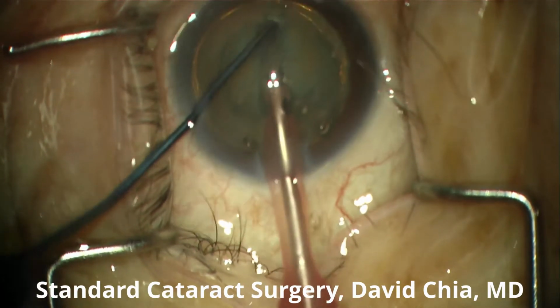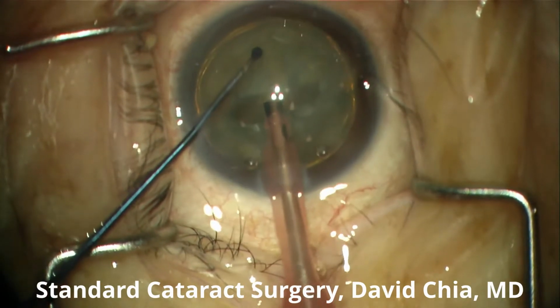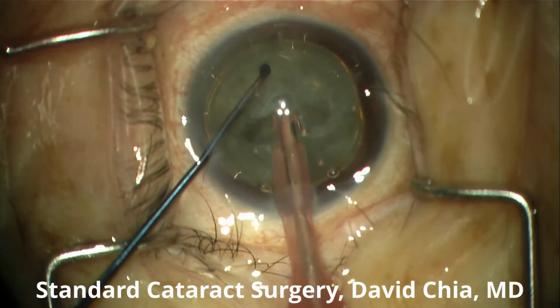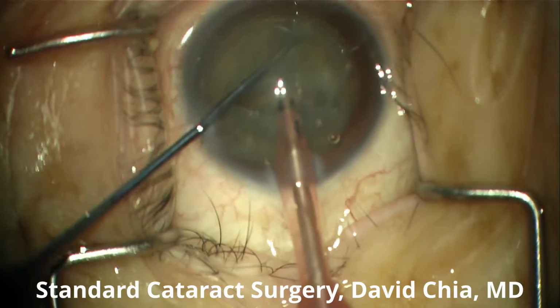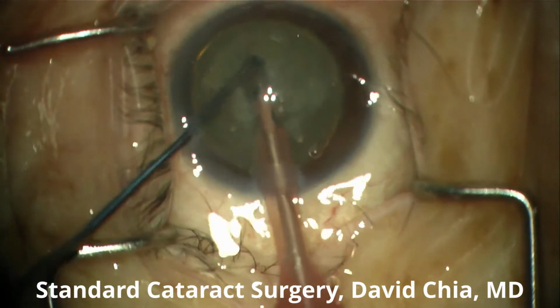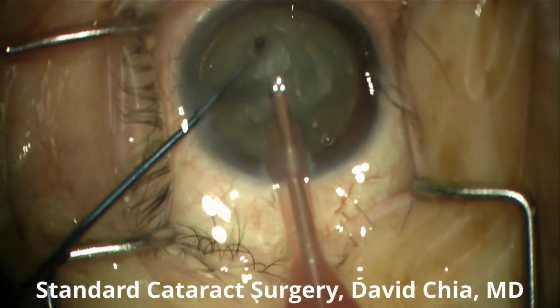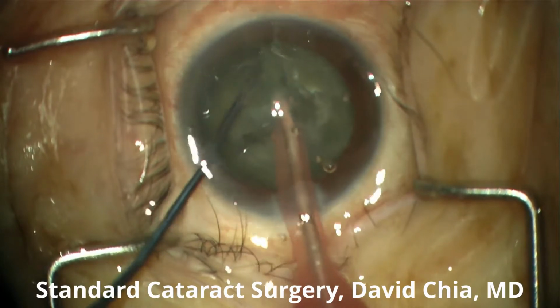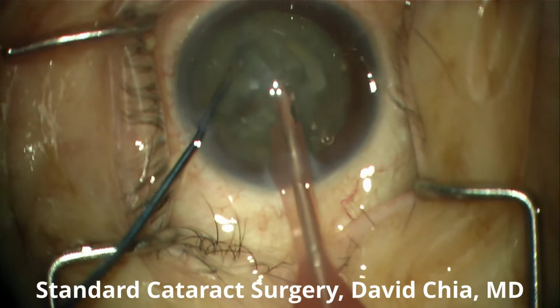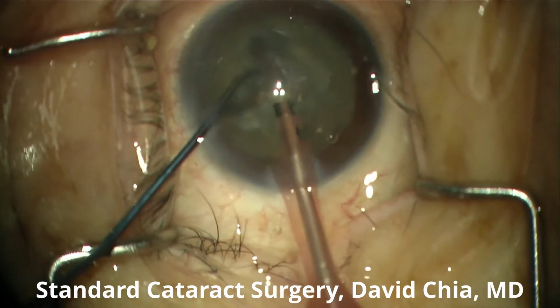It appears that this is freeing fairly well, and so we're going to be using the stop and chop maneuver to create 4 quadrants. Here we're using a horizontal chop maneuver to basically break it into 3 pieces. So each heminucleus, or half nucleus, is then broken into another half. So now we've created 4 pieces. We're changing modes and then we're removing each one of these pieces in turn.